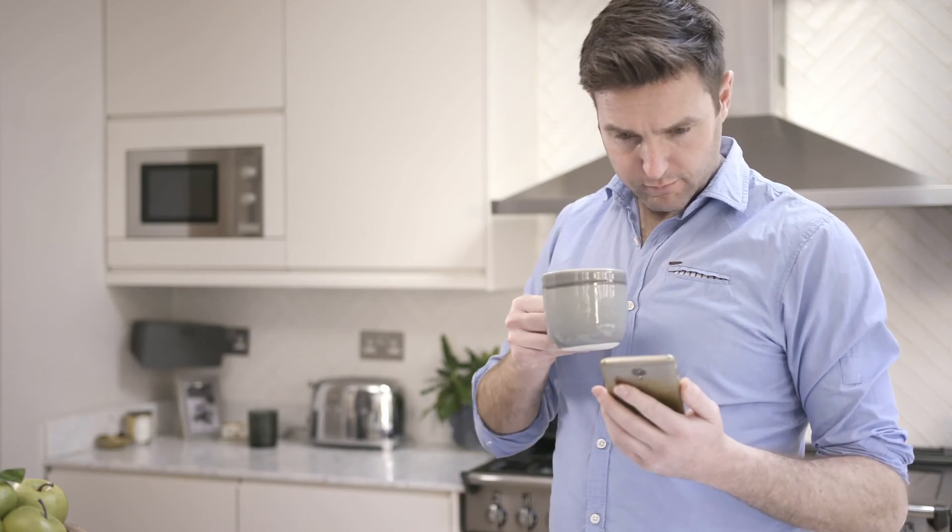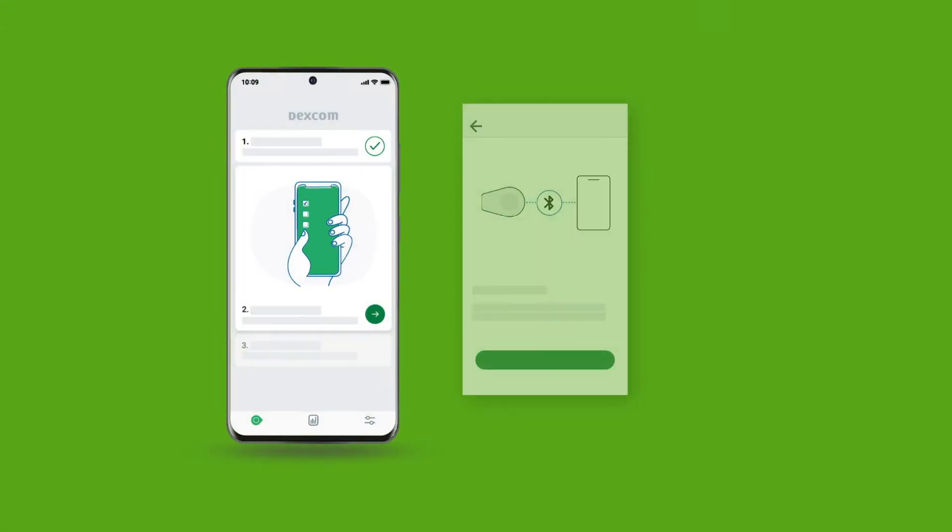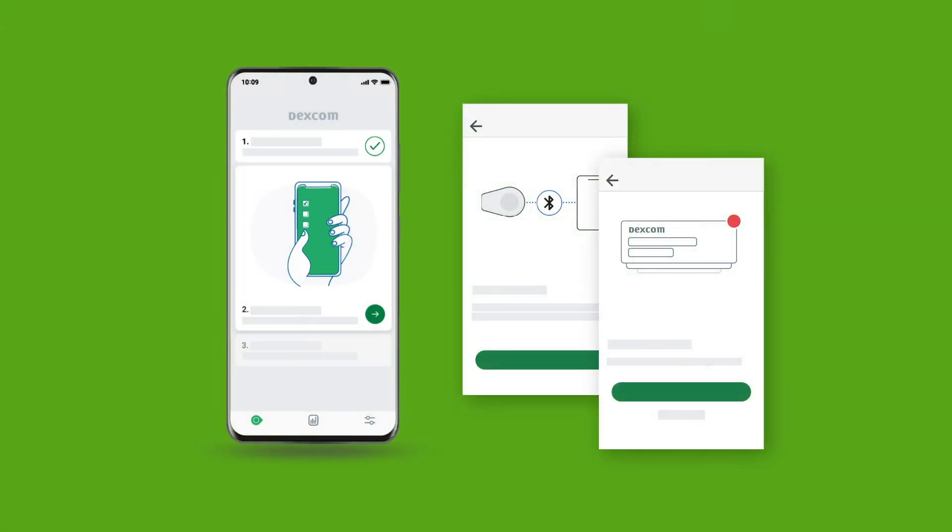Read the information about readings, alerts, treatment decisions, and safety. The app will then walk you through connecting your phone. You will need to enable Bluetooth and allow notifications.